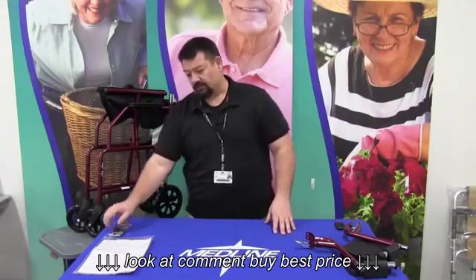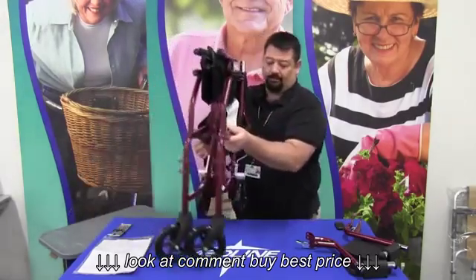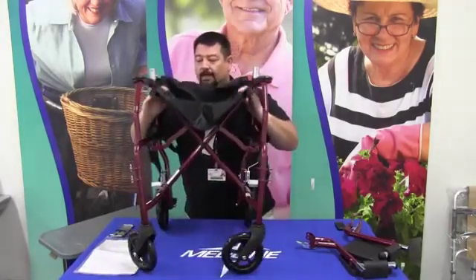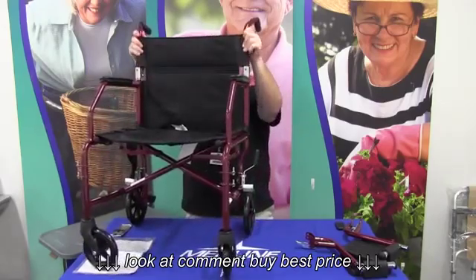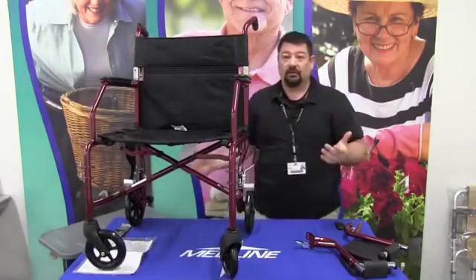The chair itself doesn't require any assembly. You simply pick it up, open the chair up, flip the back up, and that's all there is to it.